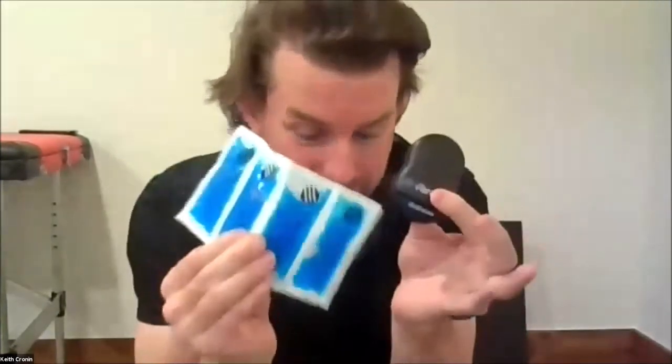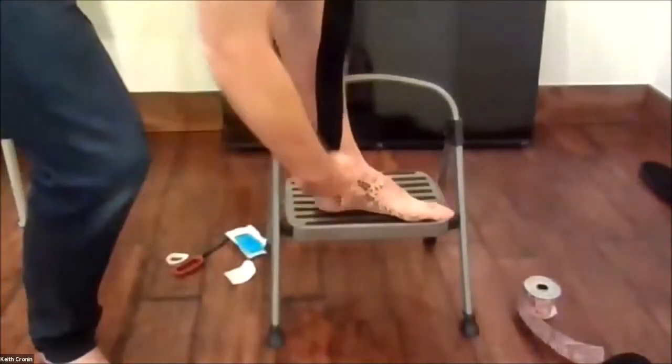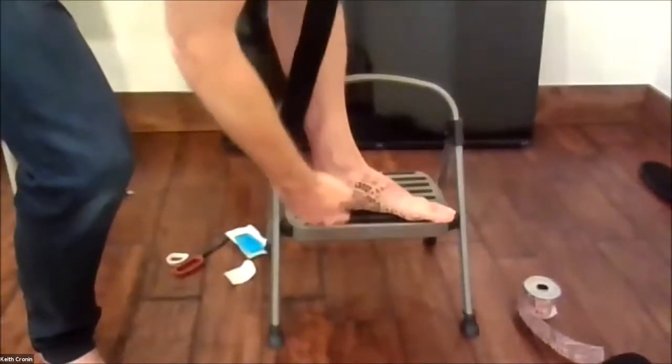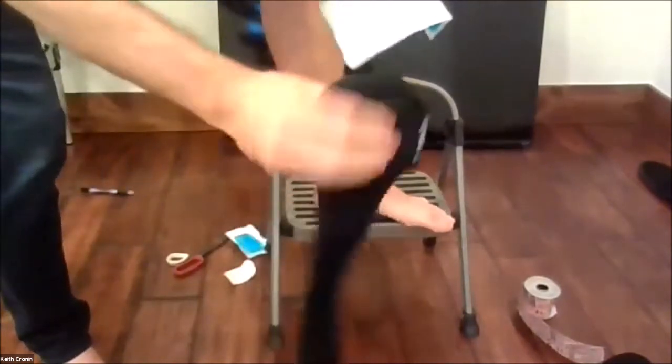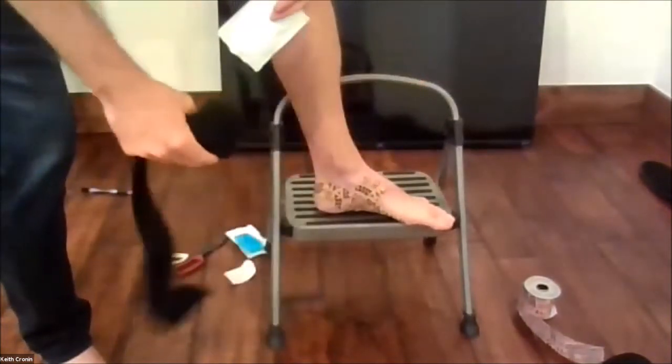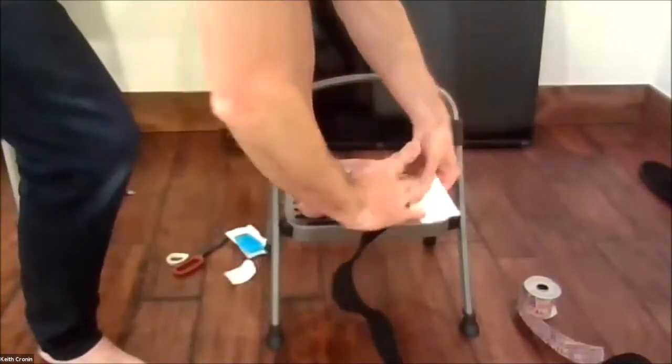All right, so to do this, all I have to do is stick these two things together and put it over the foot. Here's what's fun, right? I remember before, I'll pull this up again with my camera. I'll pull this down. Here's my foot. If I had a TENS unit and it hurt here, where do I put the pad? It won't go over the tape. Well, guess what? Mechanical vibration does not care that tape is here. Okay, I can go put my little cold pack on here.